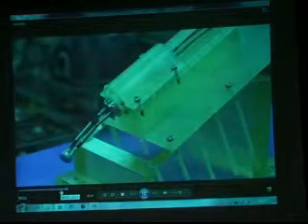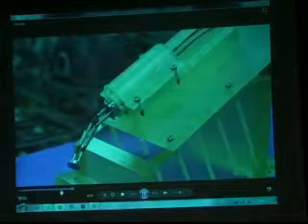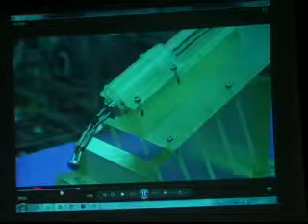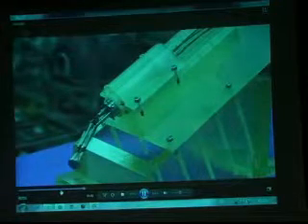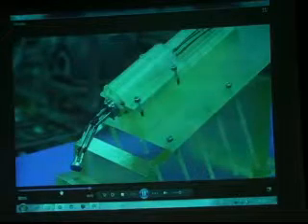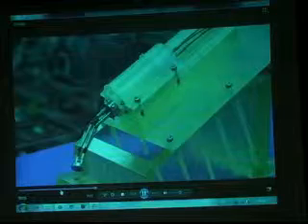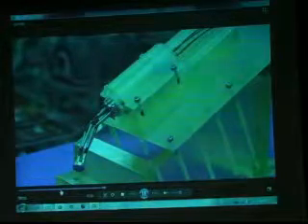As you see here, there is no wire. The robot is very rigid, and the operation is by linear motor outside the abdominal wall. Here, you can consider the abdominal wall is here. The robot can bend freely and can cover a very large workspace. And of course, it's still a prototype, and you can fix the tool here. Still, we are developing the tool, but I will not show it today.